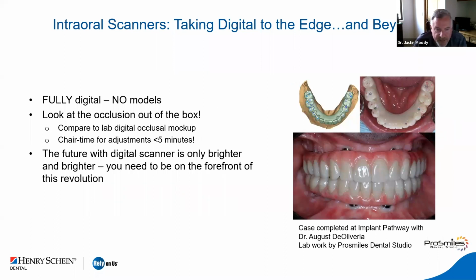When we say fully digital, digital means different things to different people. And even if you take regular impressions, when you send it to a lab today, most laboratories that know what they're doing, especially implant-wise, they're going to scan it and digitize it themselves. So a lot of it is why don't we do that in our own environment to allow for the laboratories to have the best information possible.